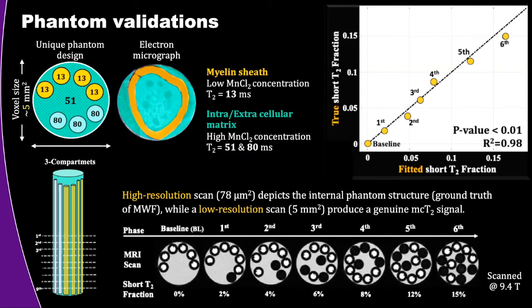So this is a very important point, and testing different levels of molecular exchange between the compartments is important. As I said, the literature does state that we are in a slow exchange regime, which means that we should be good. But I have to admit that I don't really consider this a reliable report. There are a very small number of reports. So running phantom validations with exchange is the next step, by all means.